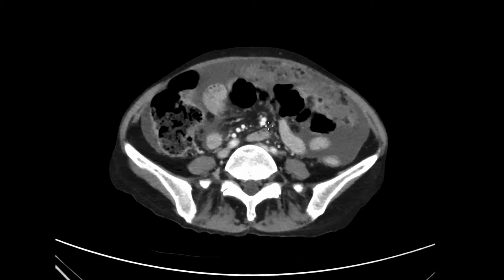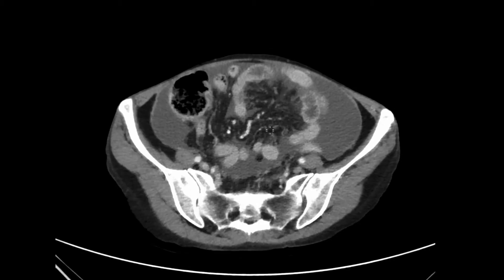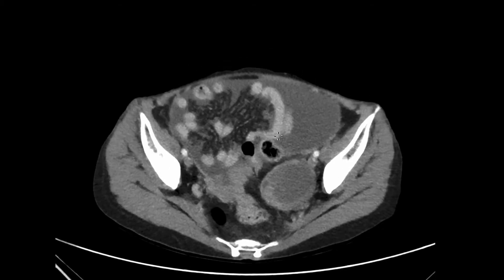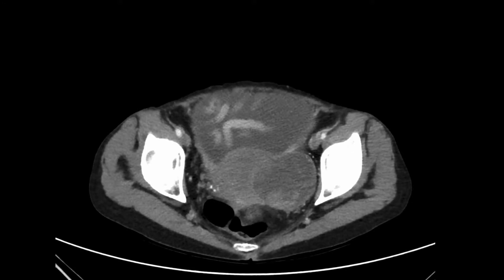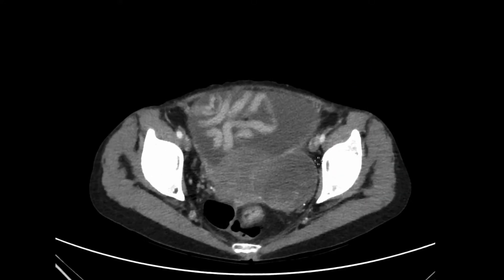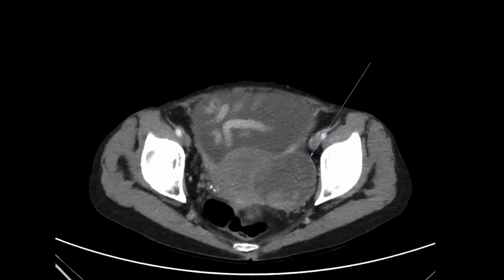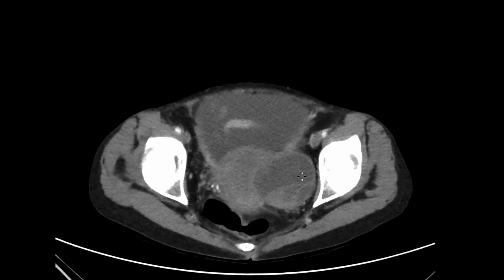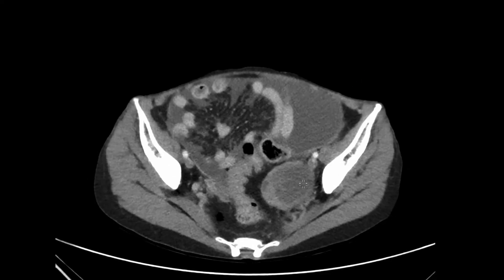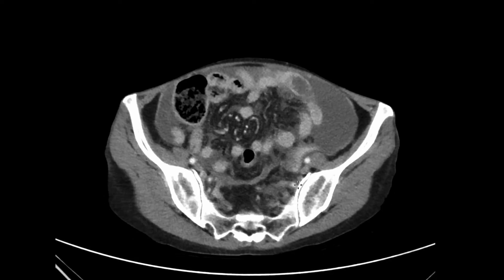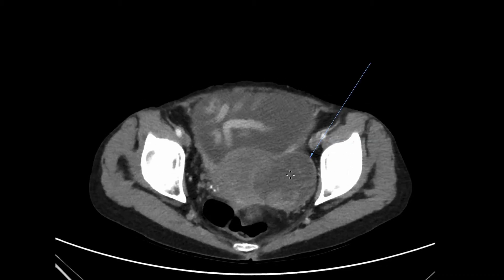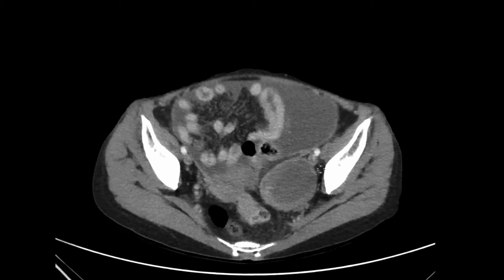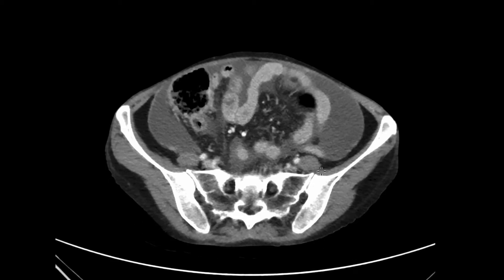Moving back down to the pelvis — the patient presented with pelvic pain. You can see in the left adnexal region there is a large ovarian lesion which has solid and cystic components. It's well circumscribed. In the context of cholangiocarcinoma, the left ovarian lesion is consistent with an ovarian metastasis, also known as a Krukenberg tumour.